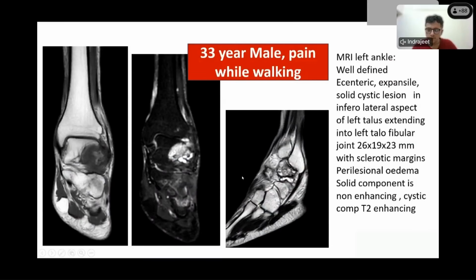Yes, when you have the HNE, something else is not there. I agree. What we are seeing is that there is edema, and it is relatively well defined. There is no soft tissue that we are seeing. The cortices are actually maintained. So this is some lesion which is looking like it is in the benign aggressive category, where there could be some benign aspect, but because of the edema, we call it a benign aggressive lesion.